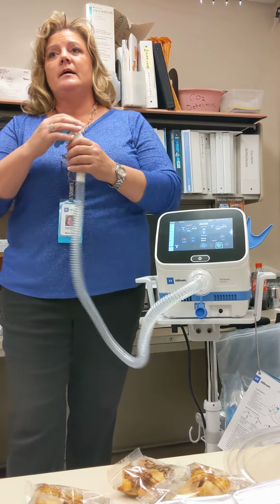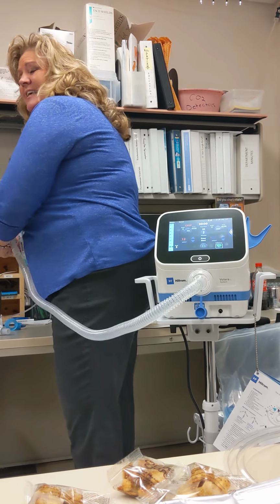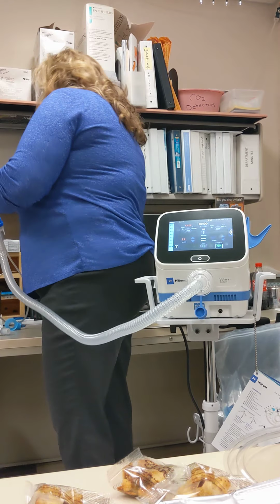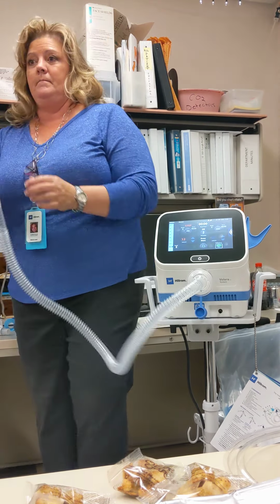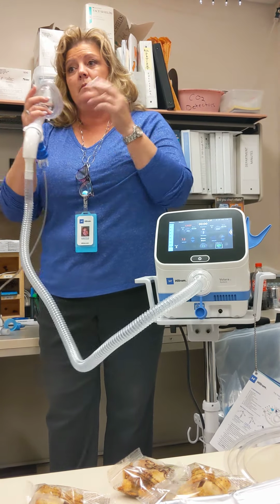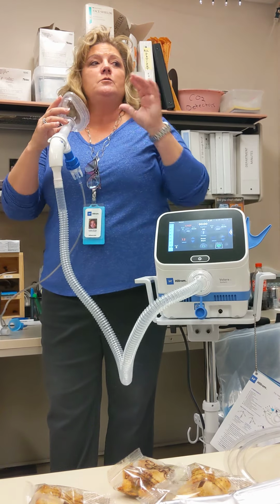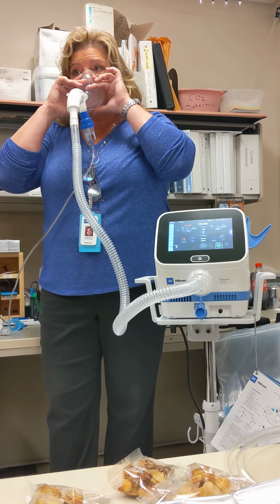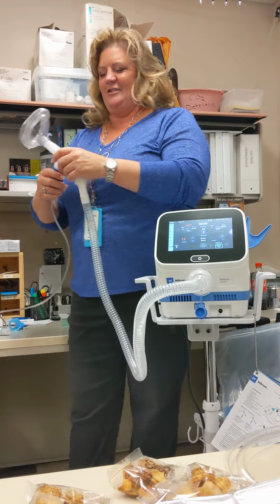You guys use that person, they're like, oh, 10 minutes, I can't keep my mouth shut for 10 minutes. Or I can't bite down for 10 minutes. Well, you know what, then we're going to put this on you. And you're going to hold it. And you can hold it for 10 minutes. And then you get a nice big seal. And especially with the non-compliant, that's a good seal. I like that. And then, yep, you got peace for 10 minutes, just kidding.